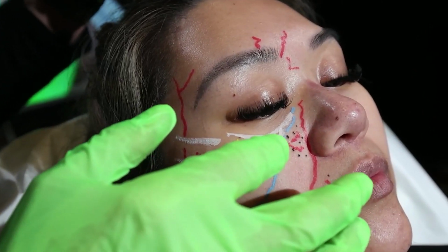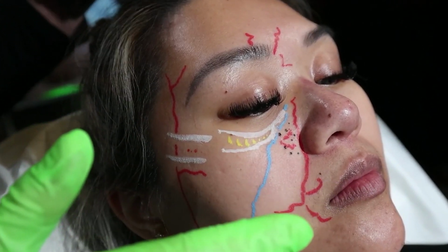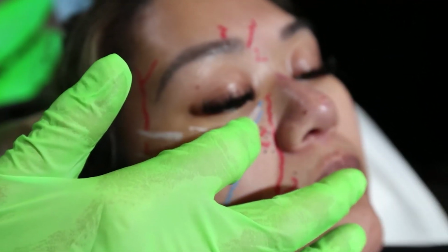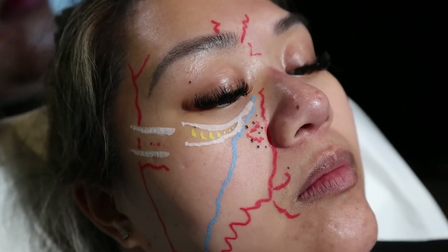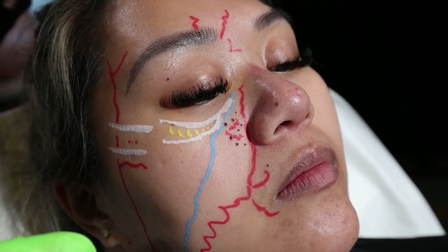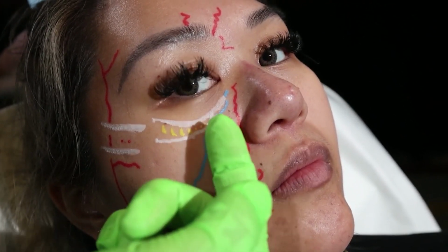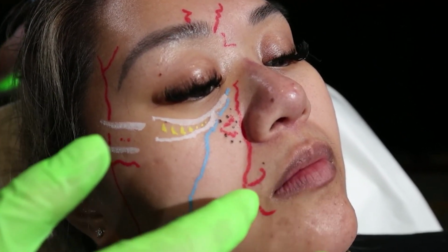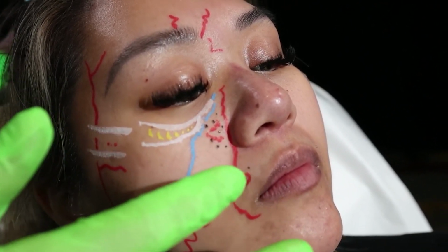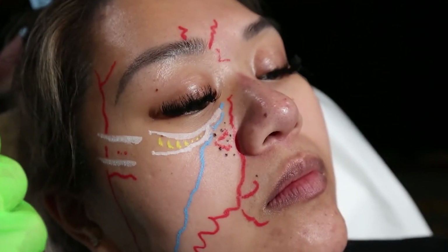You can put filler lateral to that and massage it over, or you can do this with a cannula. I personally never go medial to the medial limbus with a needle. I do go with a cannula. Dr. G has done a great job of emphasizing the fact that you should never, ever, ever go up with a cannula. Just don't do it. You can get into the artery, you can get into the vein, and you're just asking for trouble, and that's a direct route right to the back of the orbit.